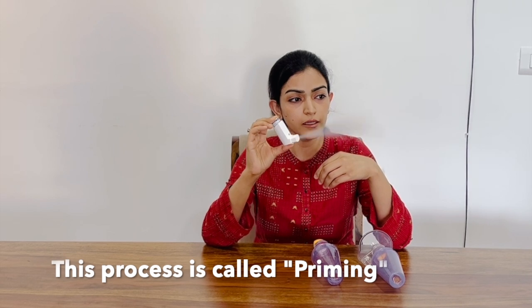The medicine is brought out of the inhaler with the help of another substance called a propellant. So it is very important to shake the inhaler well so as to mix the medicine and the propellant together. If your inhaler is new or it has not been used for a week, you must release 2 puffs into the air so that the initial amount where the medicine is not there gets removed. You don't have to do this every day, only when the inhaler is new.